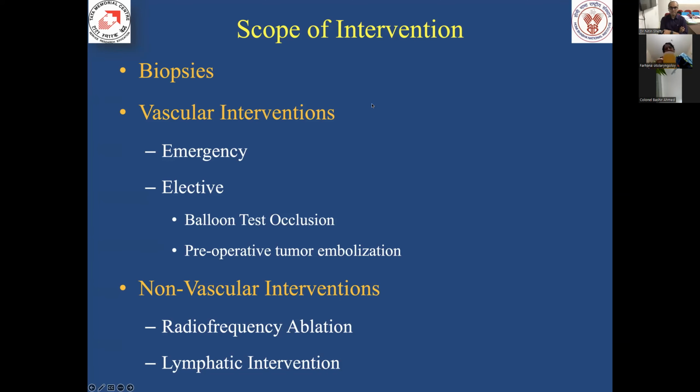Another modality which can be confidently used is MRI. So contrast MRI and CEUS, these two will tell us whether the lesion is active or not. We need to understand that unlike surgery, soon after ablation the lesion would not disappear. The size would remain the same, but it would be inactive. Most of the studies I mentioned say that shrinkage of the tumor starts from 6 months. In the first 3 months the ablation zone becomes bigger, but after 9 to 12 months it shrinks. So we can follow up with contrast enhanced ultrasound and contrast enhanced MRI both to see the activity of the lesion.